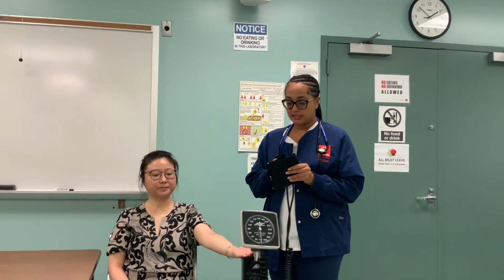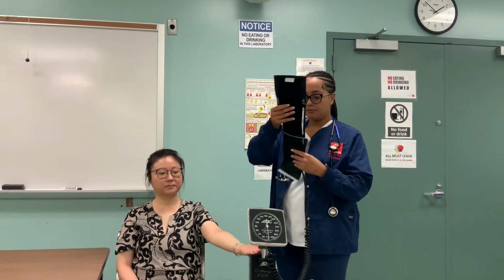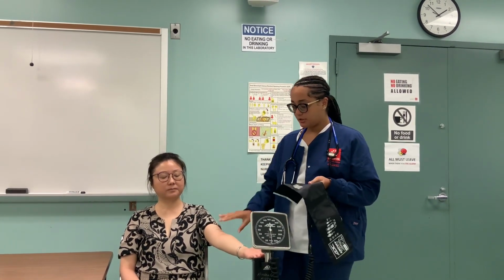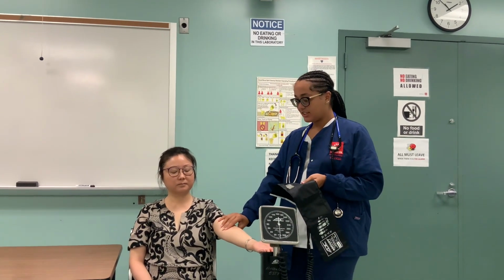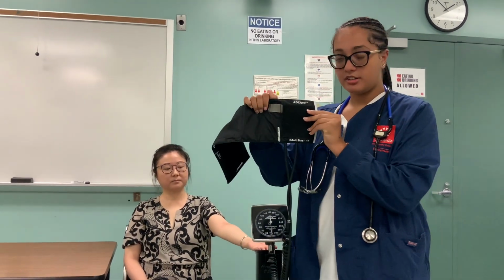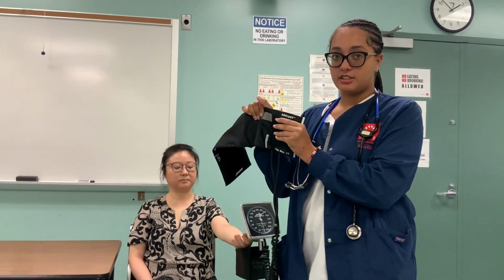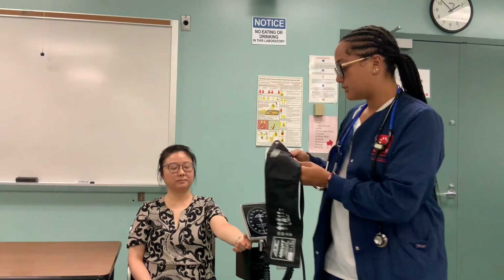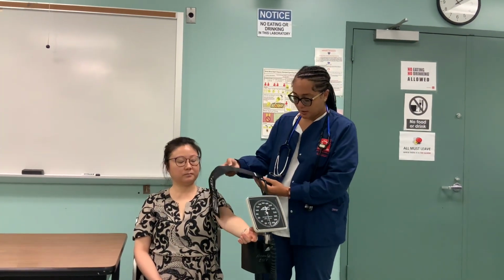And when you're placing your blood pressure cuff, you want to make sure that first you're palpating for the brachial artery so that you know where to align it. And the cuff is always going to have this mark that says artery marker, and the Velcro is going to be facing up, which is a little tip that I like to use to help place it properly.